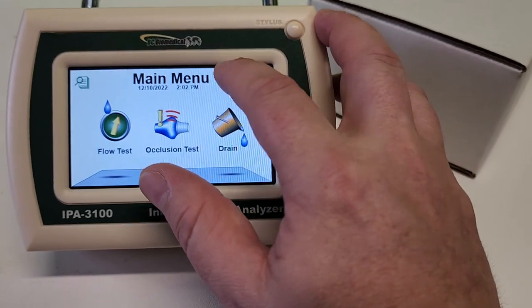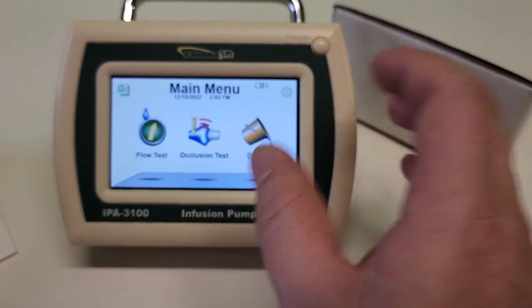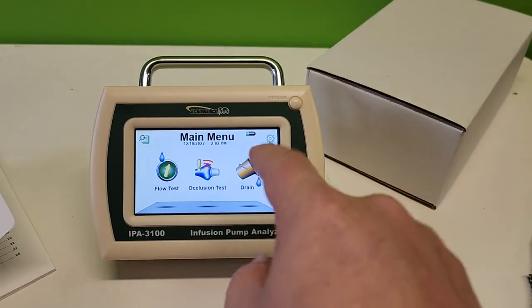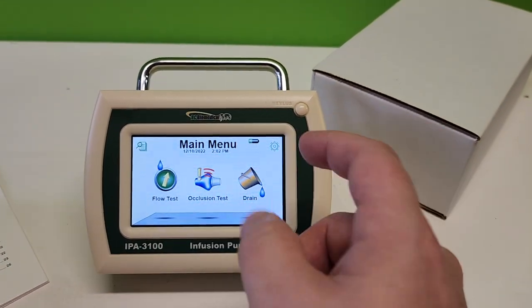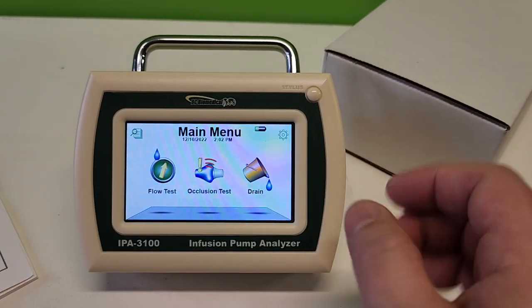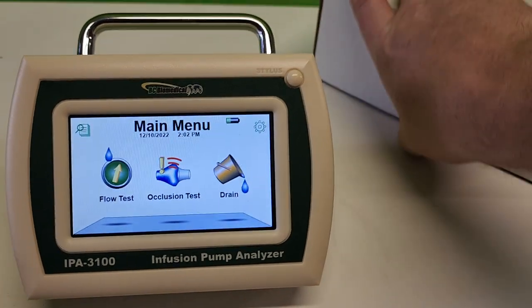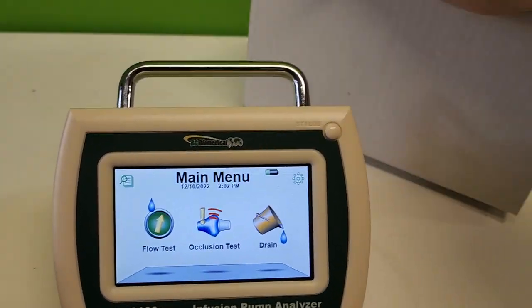I wonder how long the battery lasts. I touched the screen and it says I have 30 minutes left on the battery - that's pretty cool, I wasn't really expecting that. I'm going to go ahead and let this guy fully charge all the way up.